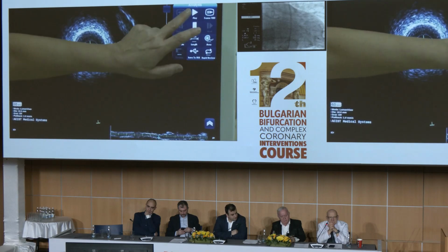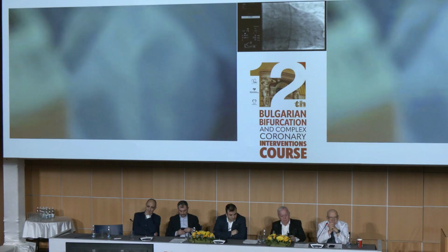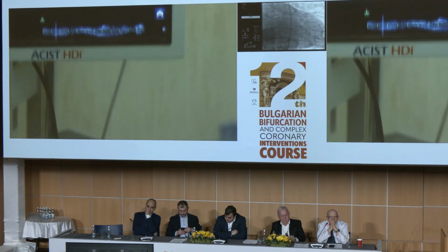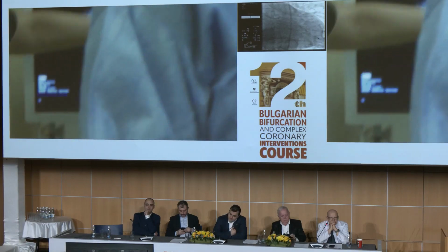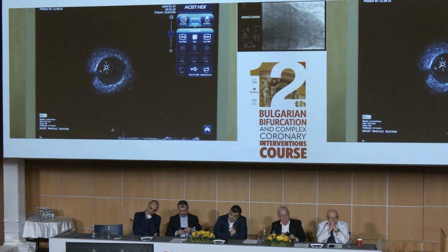So Eva will show you. Then we won't wait. Eva will show you the IVUS. There are two problematic places. The one is just around the bifurcation of this margin.